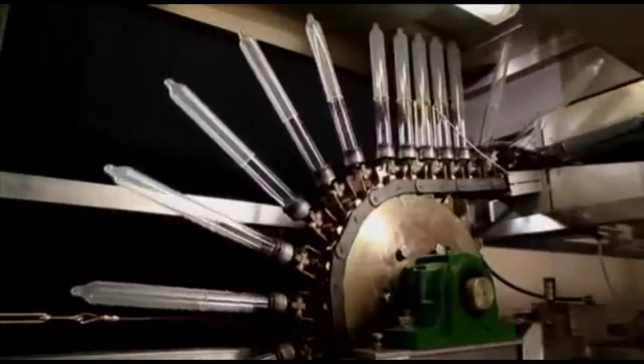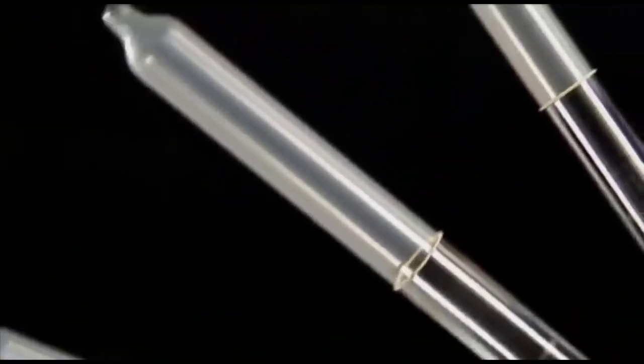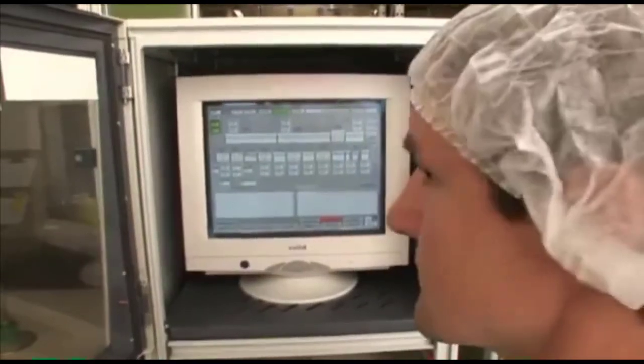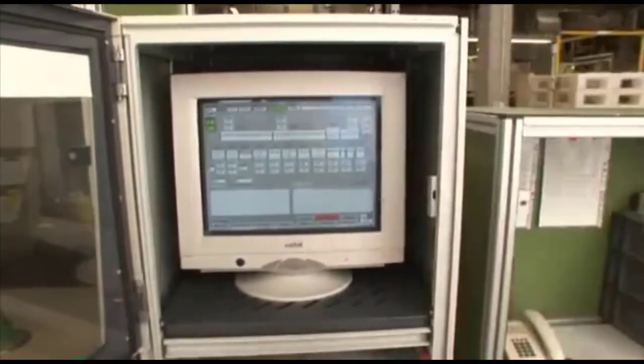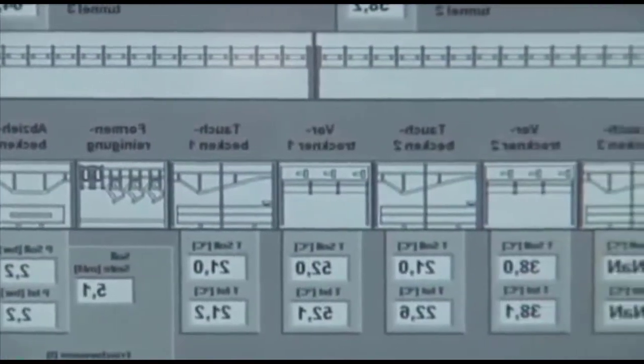To produce safe condoms with an adequate thickness, every condom is immersed and dried twice. All temperatures, as well as the immersion speed, are constantly monitored to ensure smooth operation of a fully-automated immersion chain.